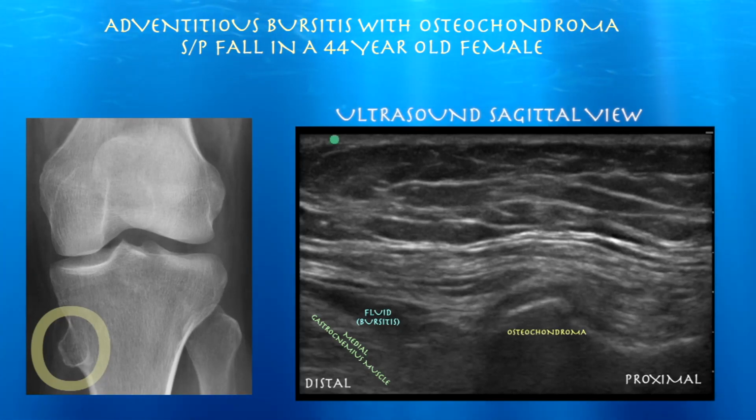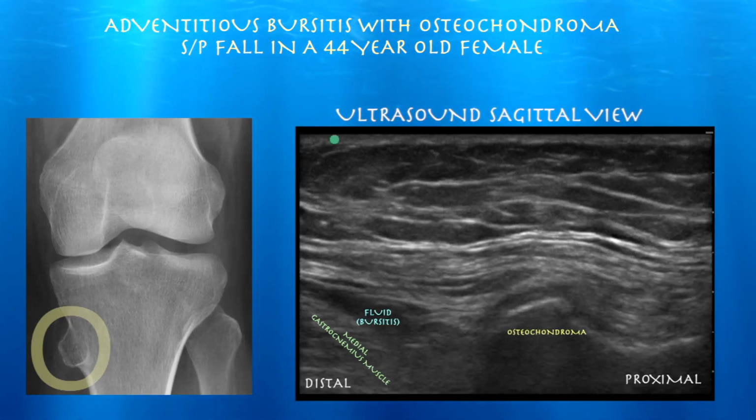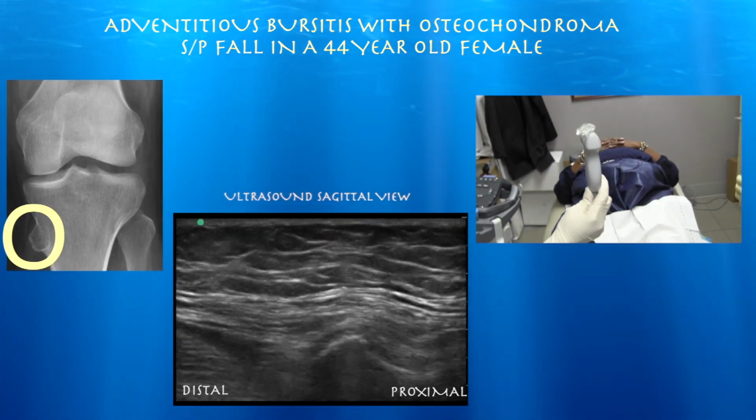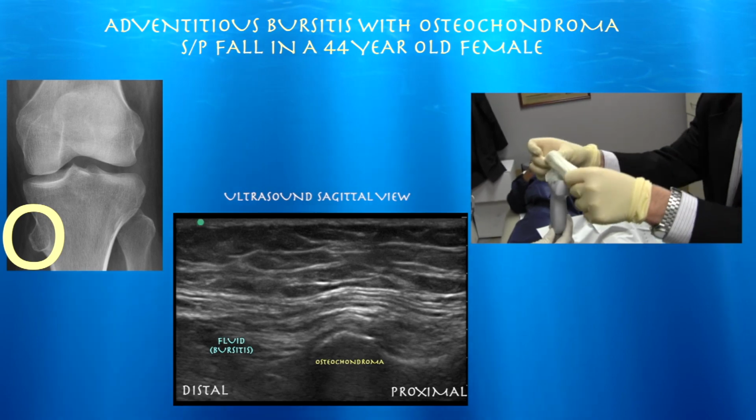This is a 44-year-old female that fell 5 months prior to seeing me. 1 month after the fall is when she started noticing some pain in the vicinity of this osteochondroma that's radiating distally towards the ankle.